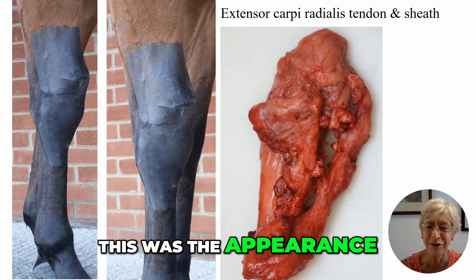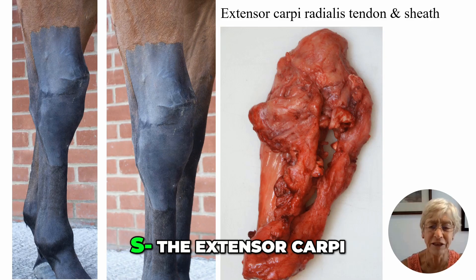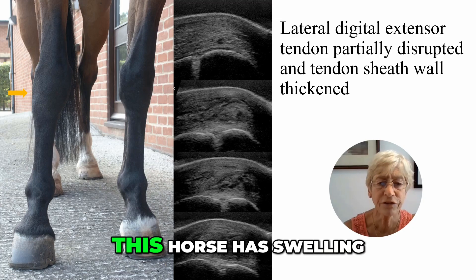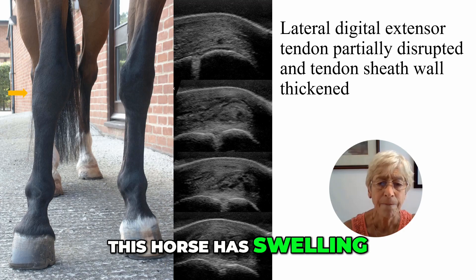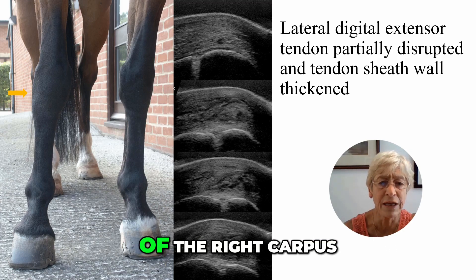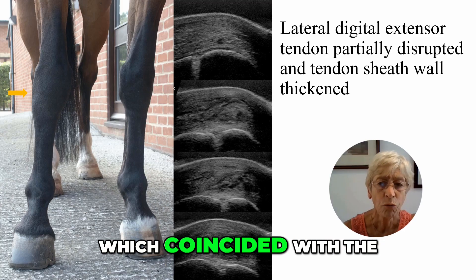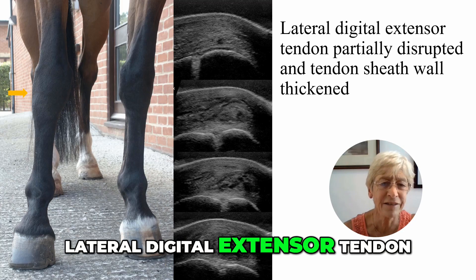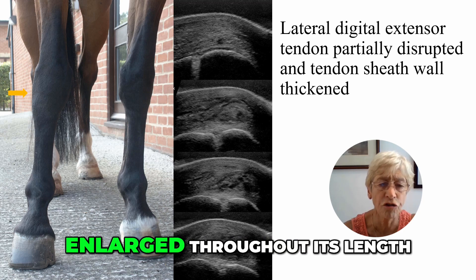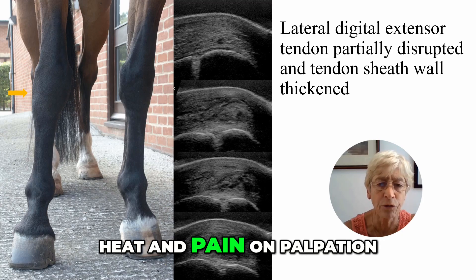The sheath wall itself is very thickened, highlighted by the double headed arrow. This was the appearance at surgery of the mass, which was formerly the extensor carpi radialis tendon. This horse has swelling on the dorsolateral aspect of the right carpus, which coincided with the lateral digital extensor tendon. The tendon felt relatively enlarged throughout its length, and there was localised heat and pain on palpation.